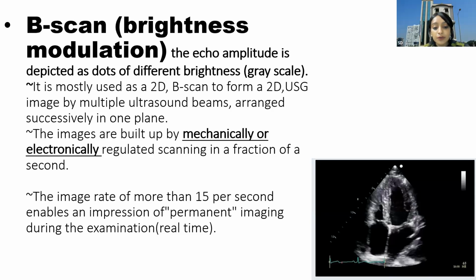So whenever we are doing a procedure, we say that we are doing the procedure under real time. That is, this brightness keeps changing from time to time, and that gives us real-time imaging.